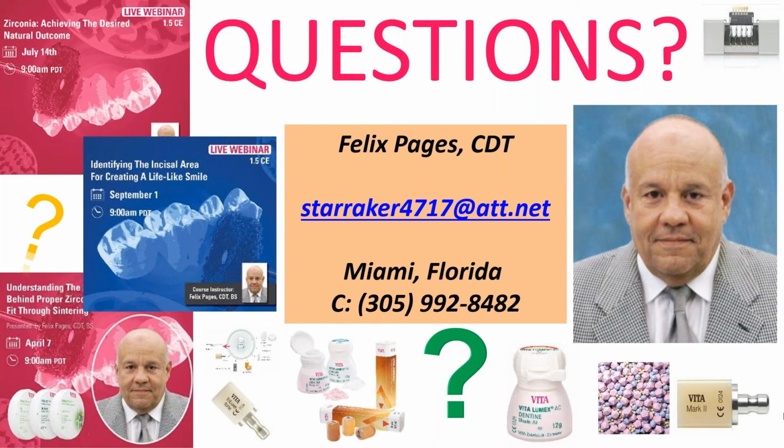Now Graham at ProLab does most of my frames, and he uses a library, and I have to call him every once in a while. I go, hey man, don't send me these things that look like a razor blade at the end there. And I don't like grinding on the zirconia once it's cooked. If you do, you have to use slow speed and water.